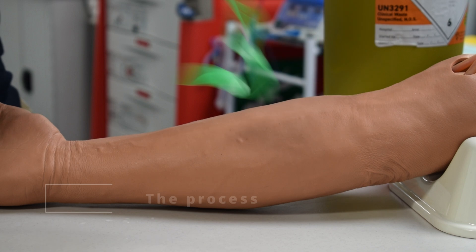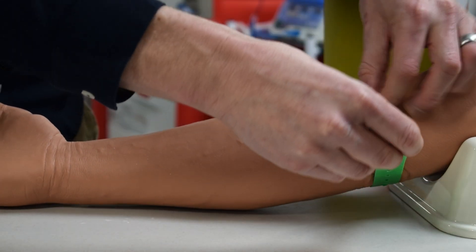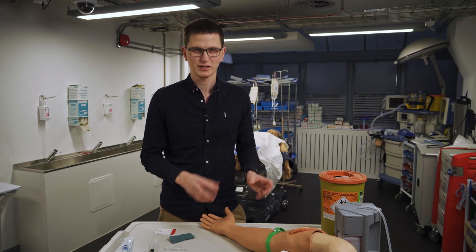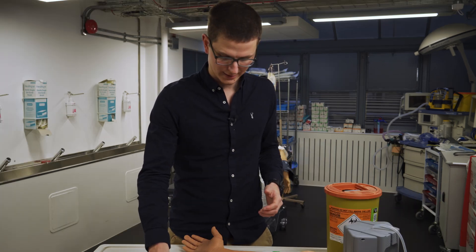First of all, we have to gain consent from the patient. Tell them what's happening and tell them why this is going to hurt. The more we say that it's going to be really painful, the less they're likely to pull away, rather than saying it's going to be a little sharp scratch when meanwhile it's very sore. We'd rather they be fully aware of what it could be like.